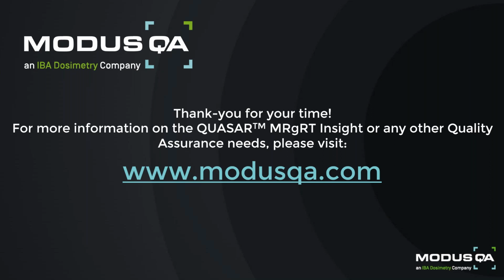So in summary, I'd tell physicists to think of it like this: the Insight is there to provide a snapshot of your distortion, as well as other metrics, within your scanner using those 2D slices. You can think of it more as a fast, IEC recommended glance at your system just to check your GD during your morning QA. It looks great and you're done.